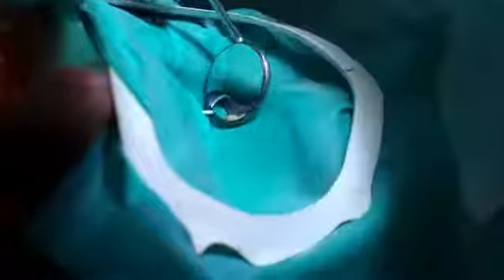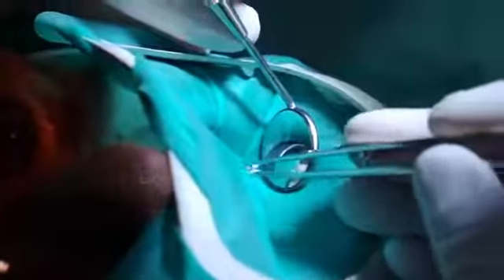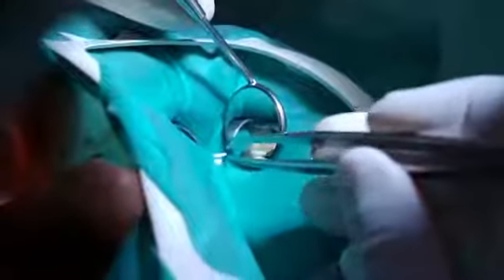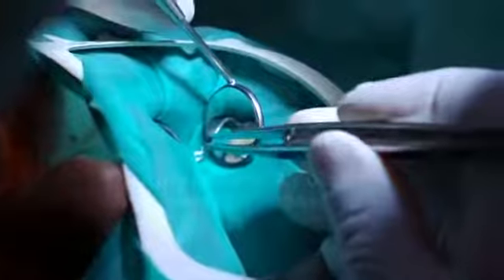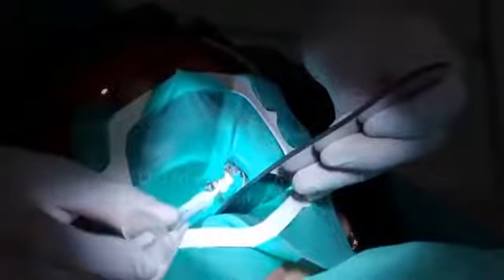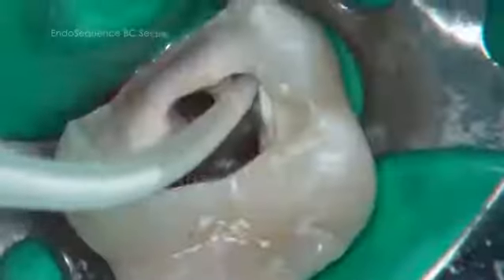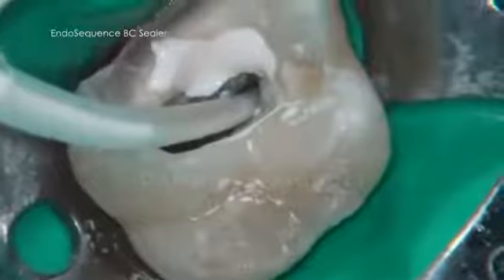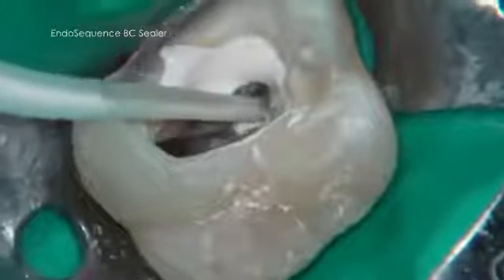The canals were finally dried with sterile paper points and filled with a pre-mixed bioceramic sealer and single cones.